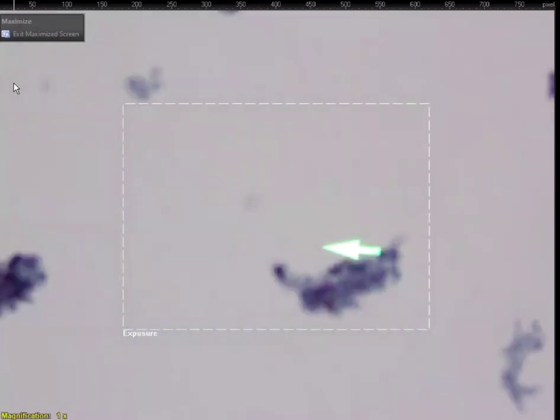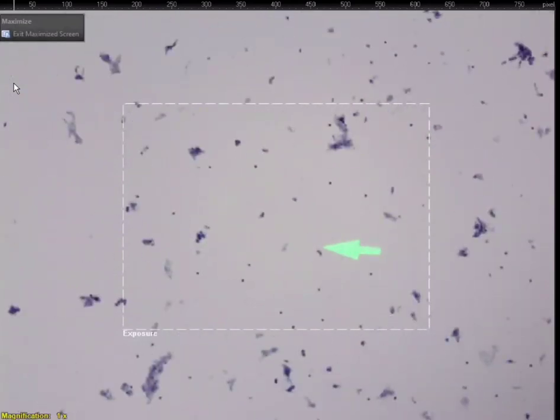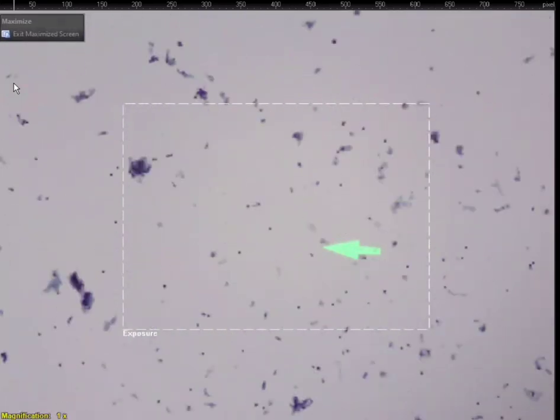Okay. So can we even, have we seen anything bad yet? No. We're seeing a very scant population of lymphocytes. Yeah. A large population of respiratory epithelium contaminated in here. Contaminant. Yeah. Not impressed. Okay.